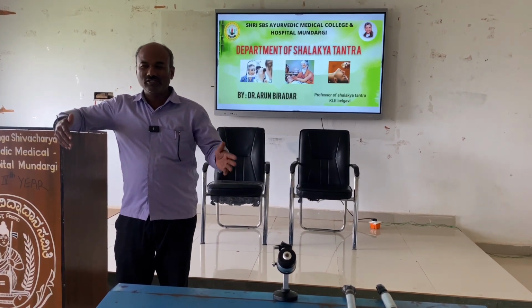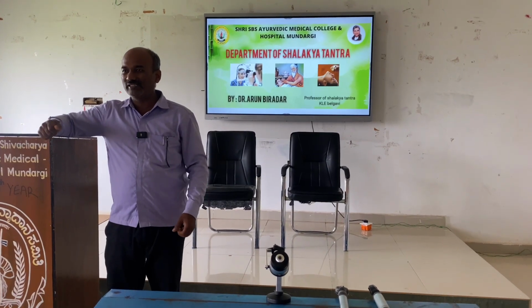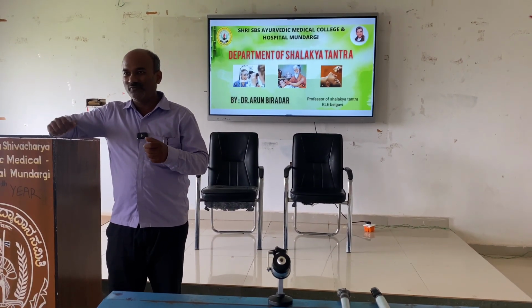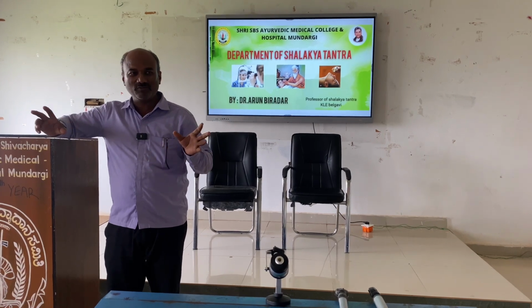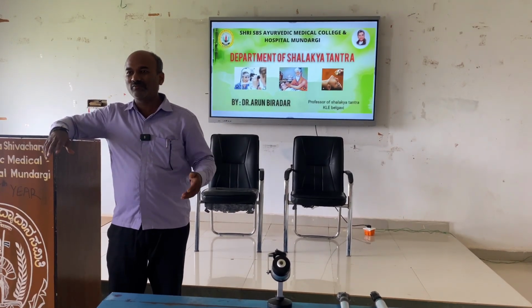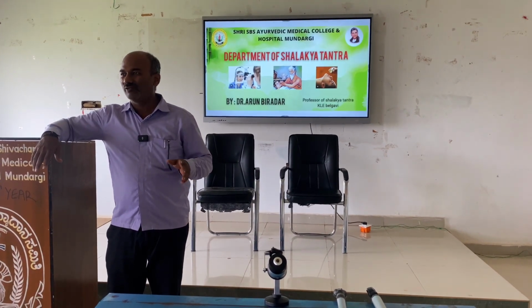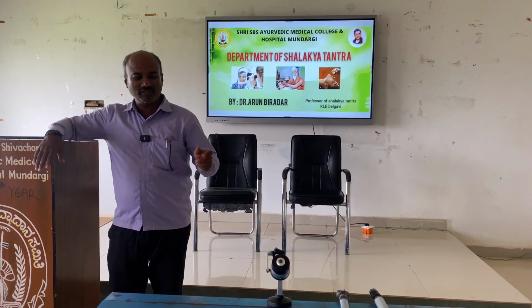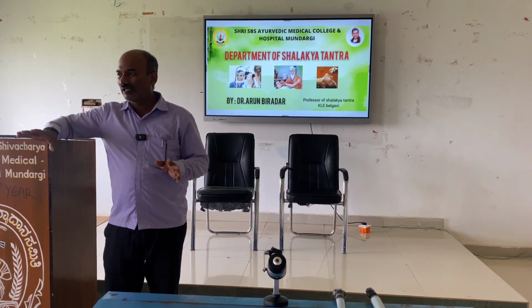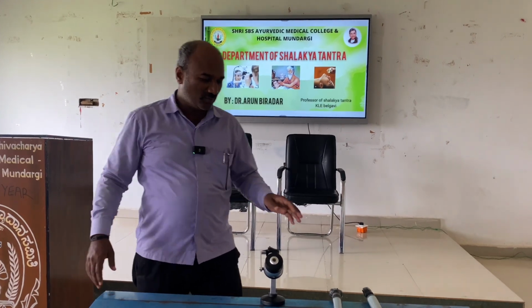So this instrument is in practice since long. Now, whatever the existing thing is there, you might not have operated button phones, right? You all have smartphones. This is a smartphone. So earlier versions of these ophthalmoscopes are not in practice, so simply wasting time on those is not required. Whatever available models are there, you should understand how to use them, right? So this is an ophthalmoscope.